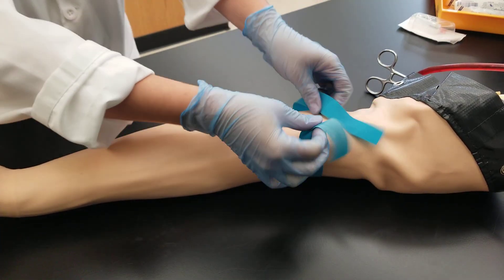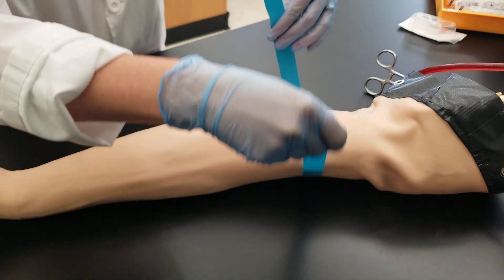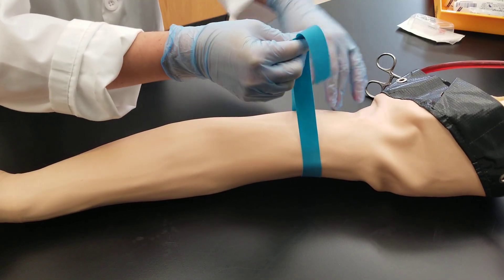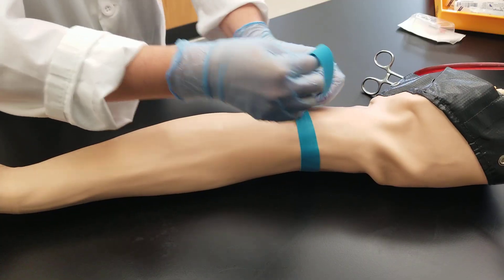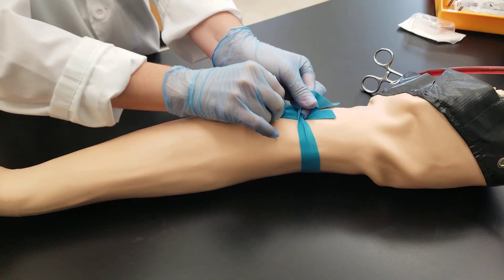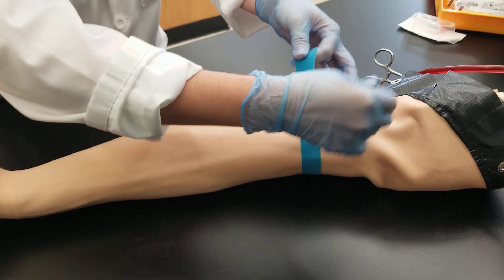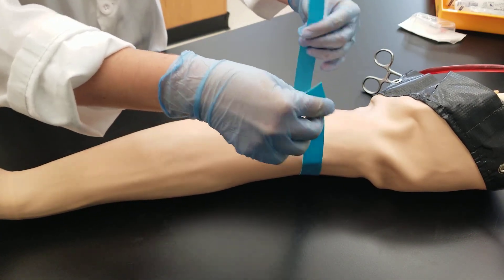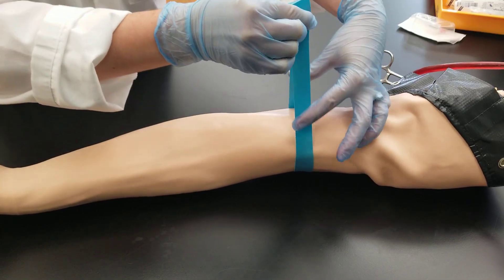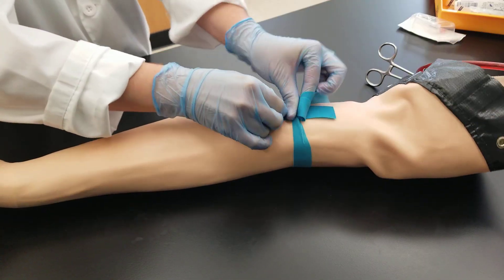It looks a bit off when done slowly, so let's release and try again at a faster pace. Hold the tourniquet up tightly, still in the correct spot. Hold it up with the right hand, cinch it down a little bit with the left while turning as you go, put the right side underneath so you have your two tails, and then let it go. Making the left side longer, holding up both, cinching down, turning, and tucking the right one under so that you have your two tails.